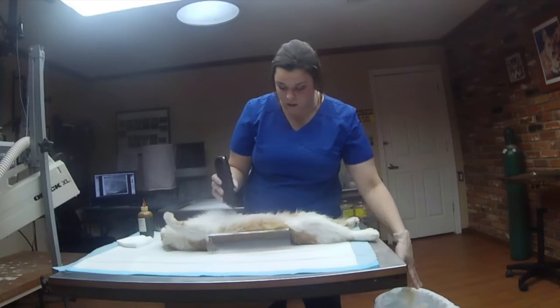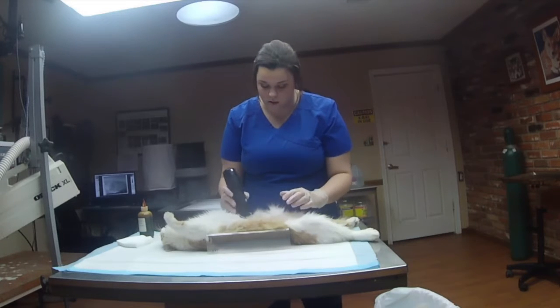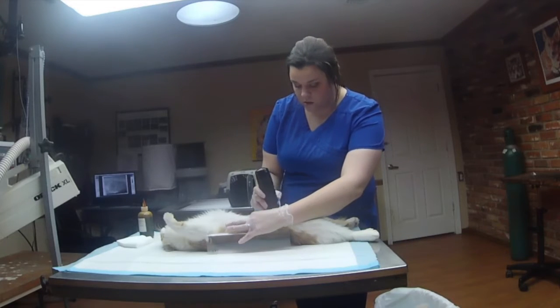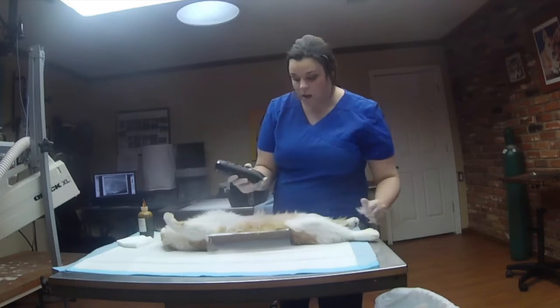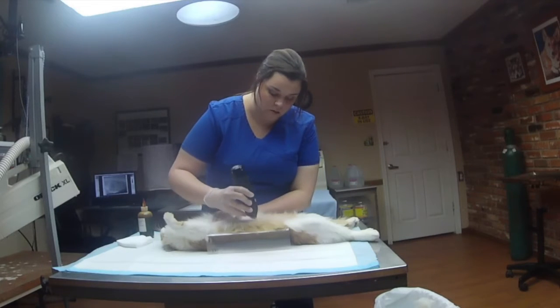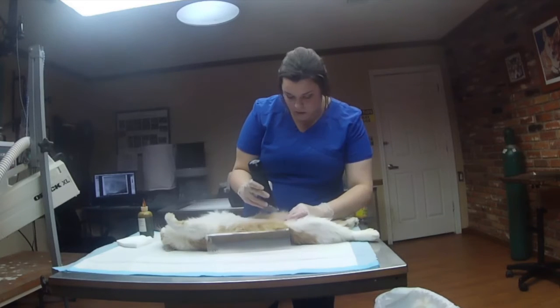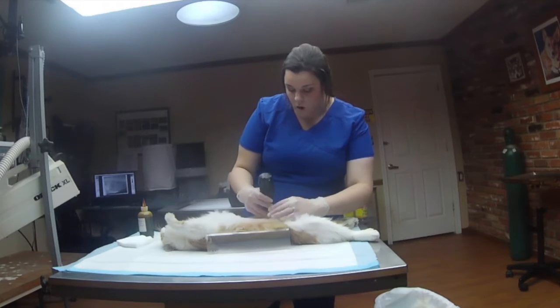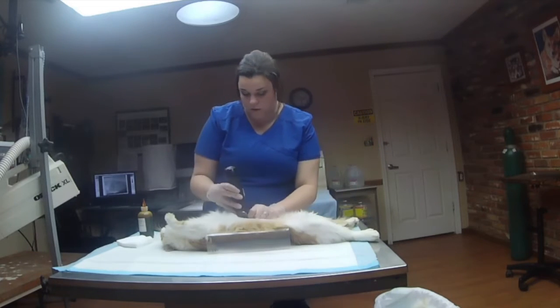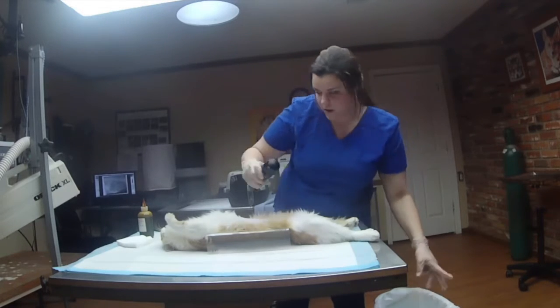So right now we're clipping the hair off, and then we will vacuum it off to make sure all the hair is gone. And you're only wanting to use surgical clippers, not something that you would clean ears with or something like that. We're going to make sure that we do one scrub in here, and then we will do more in the surgery room. The hair is away from the surgical area.